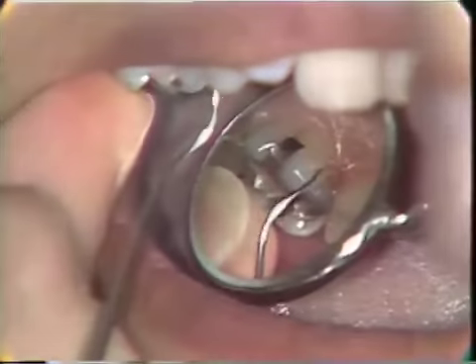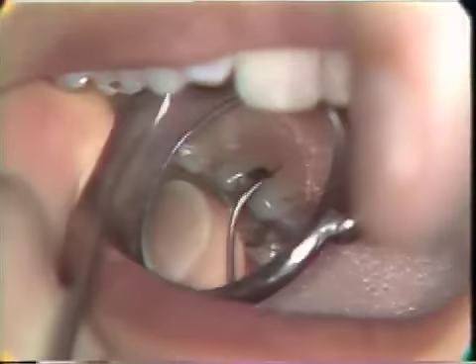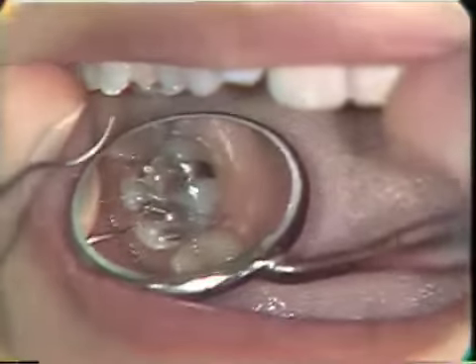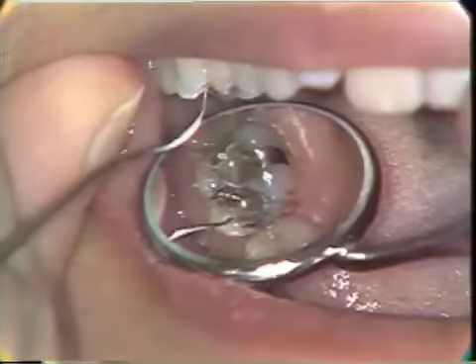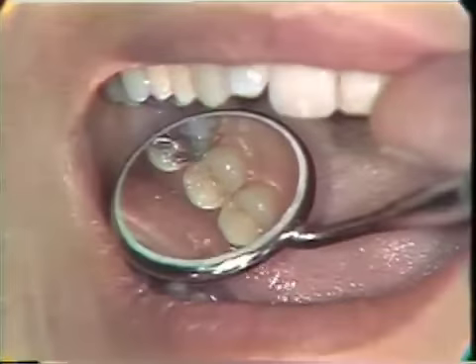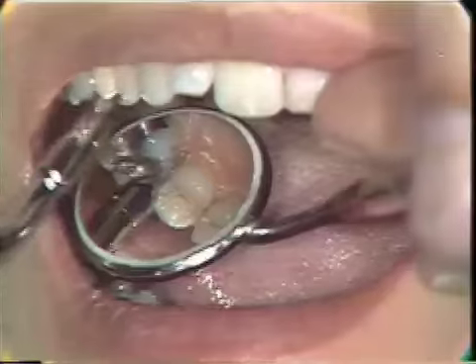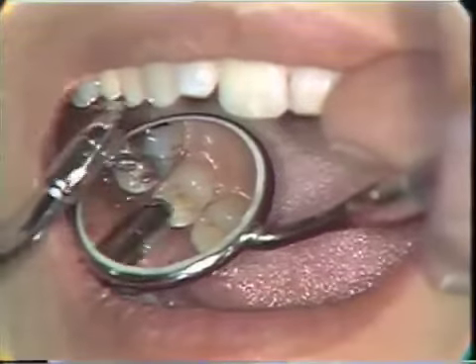Now the lingual seems to be intact. At this time, we're simply recording findings. We'll make our treatment plan later. Now, to the occlusal surface of tooth number 4. Very often we'll need a little air to clear moisture and saliva to give us better visibility.